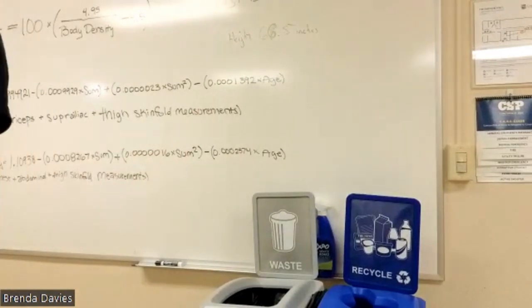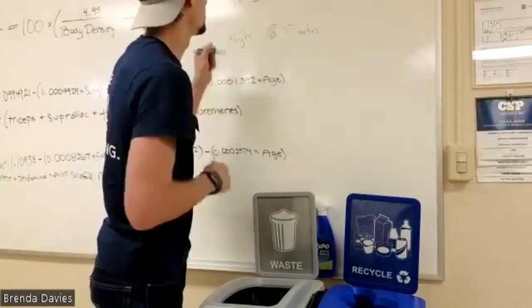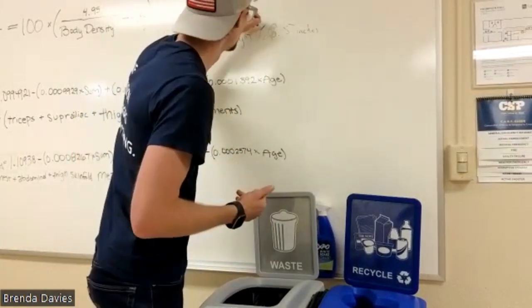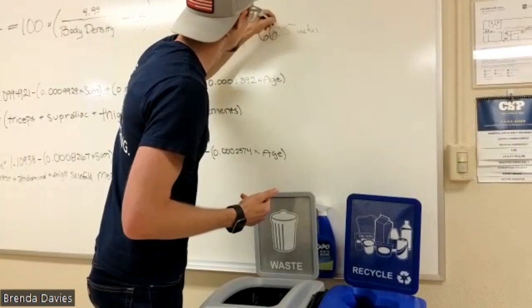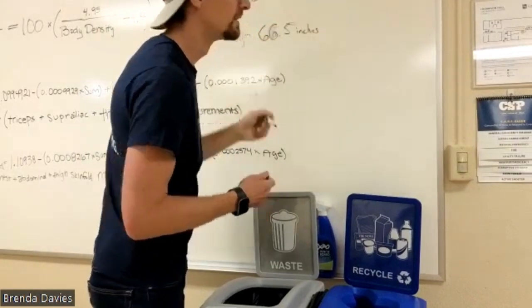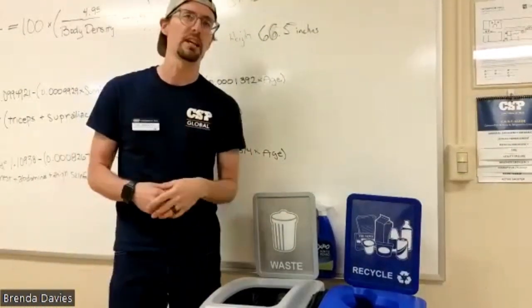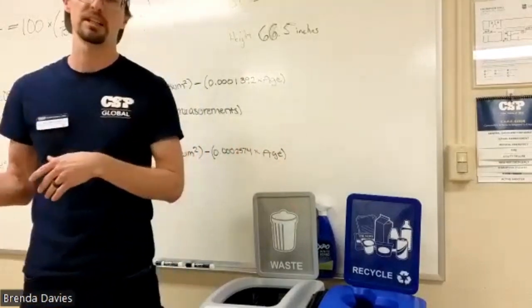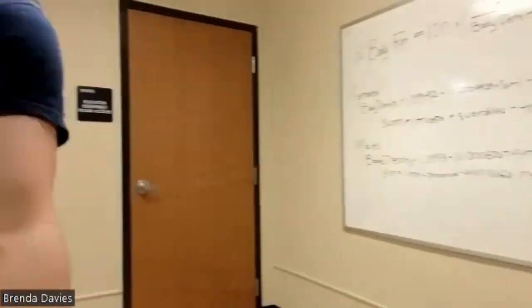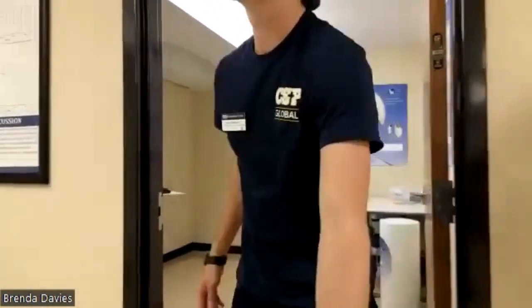All right. So the next one that we'll do is, you want to just do the Bod Pod one? Is that like the one you're most excited about? Sure. Yeah. Okay. Sweet. So we'll do the Bod Pod. The hope is that we're going to be running through each of these different assessments, and then we can compare the body fat percentage across different modes. And so we'll take ourselves over to the Bod Pod.